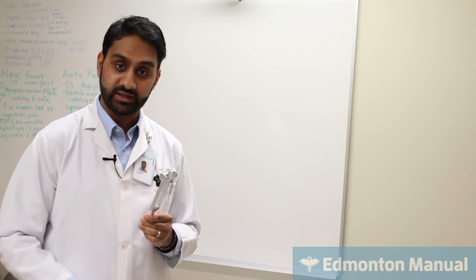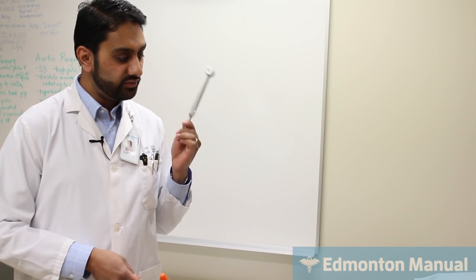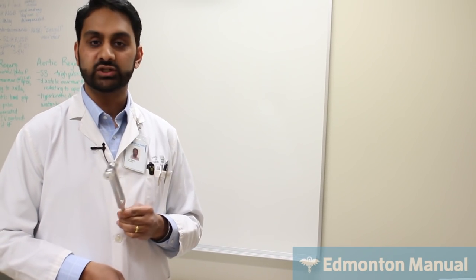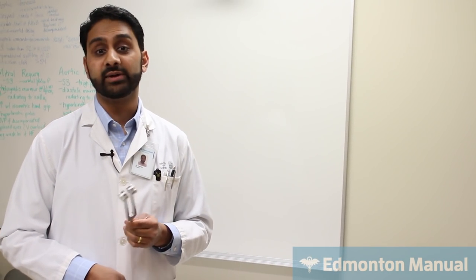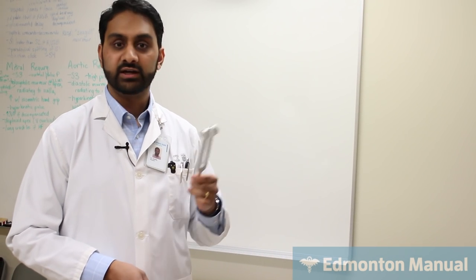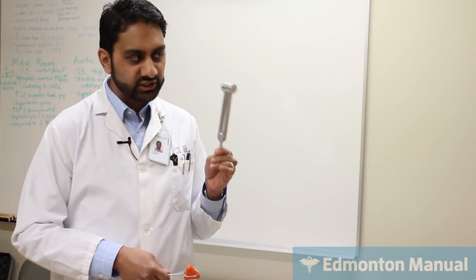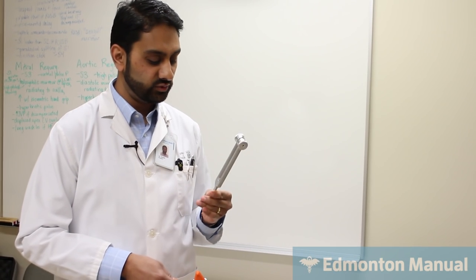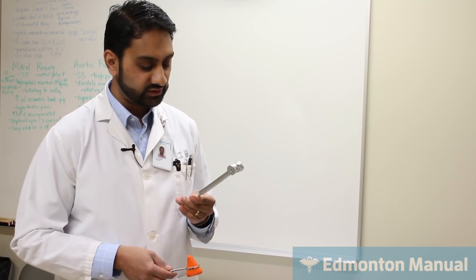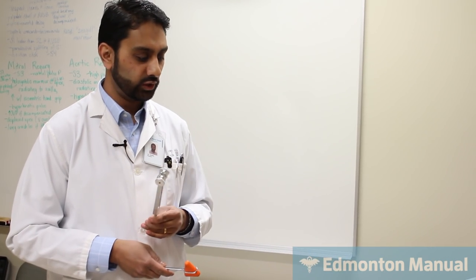Okay. So that's what's transmitted through the dorsal columns along with proprioception. This is particularly useful, especially a common example is diabetic neuropathy. And in fact, for most defects that affect the dorsal columns, that affect both proprioception and vibration, vibration actually tends to be a bit better of a test. That said, if you don't have this tuning fork on you, you can certainly do proprioception as a surrogate. But generally, vibration works best.